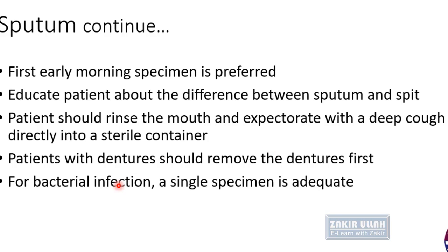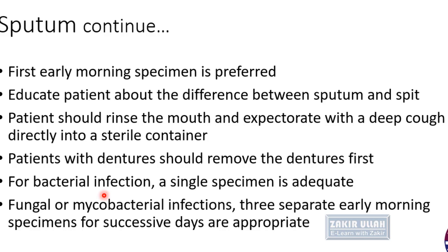In case of suspicion of any bacterial infection, a single sputum specimen is adequate for culture purposes. But if there is any fungal or mycobacterial infection, then 3 separate early morning specimens on successive days are appropriate.